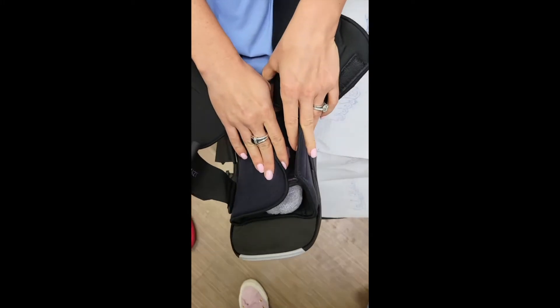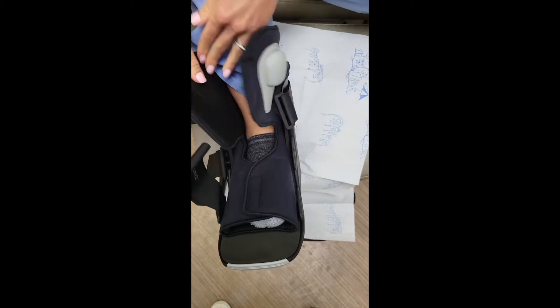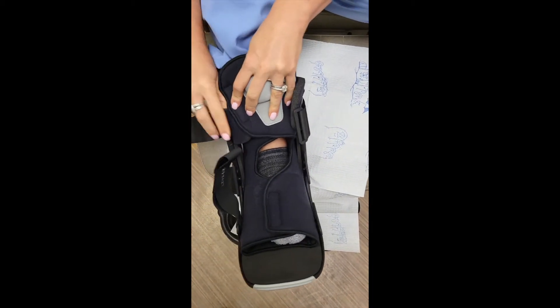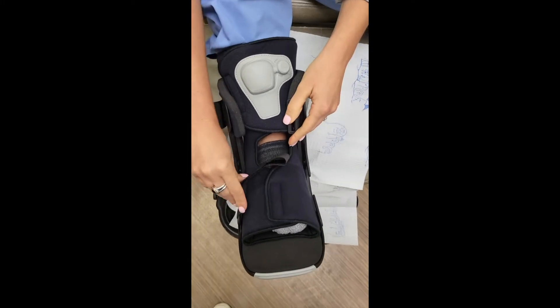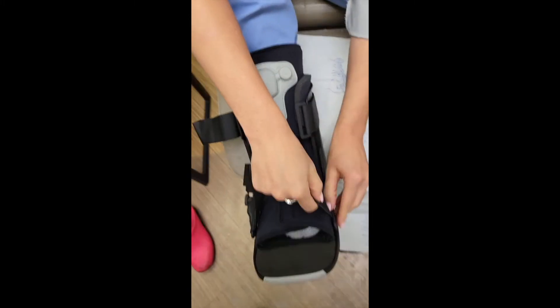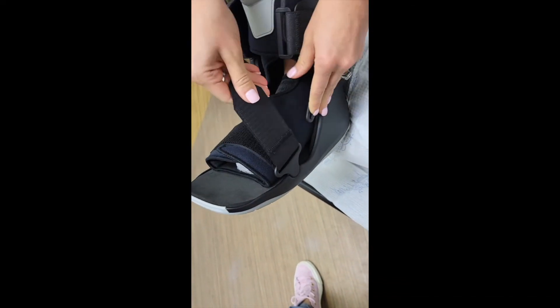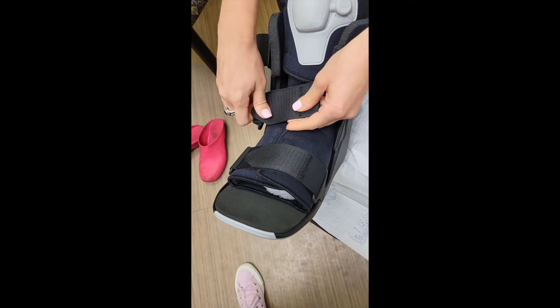You're then going to put the cushioned portions together snugly and strap the velcros. They go through these little side parts and then you're going to pull them to secure your foot.